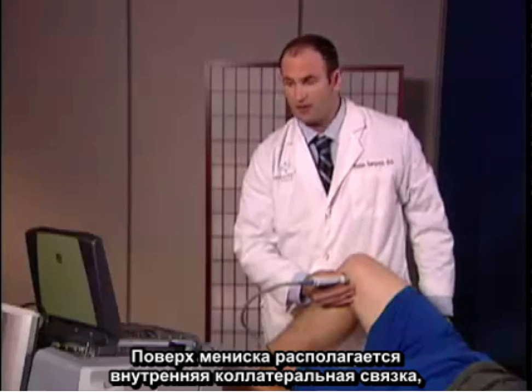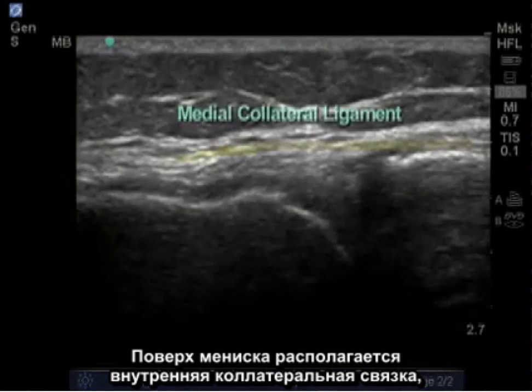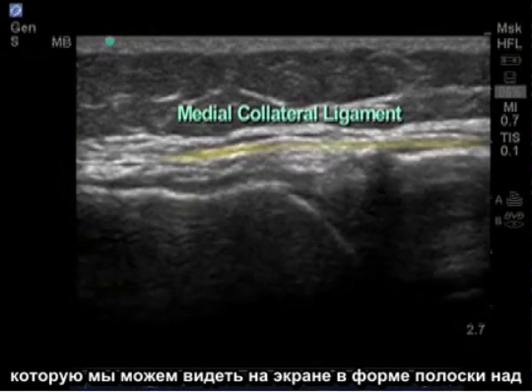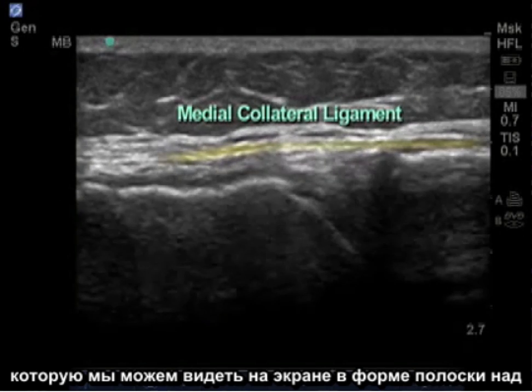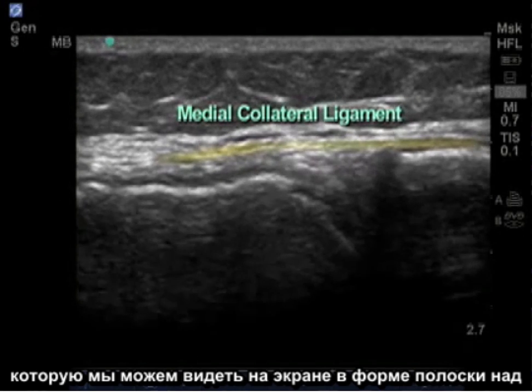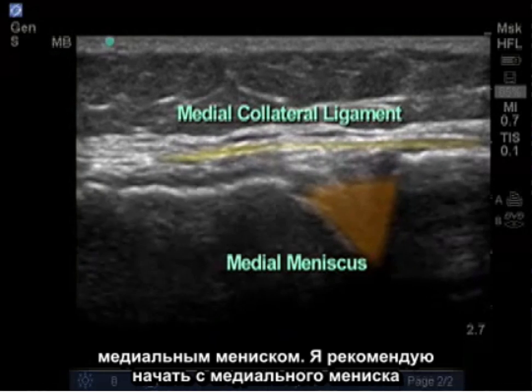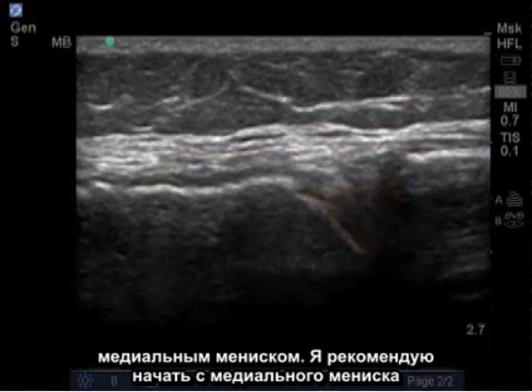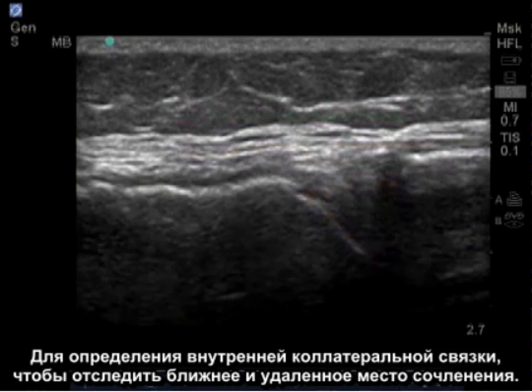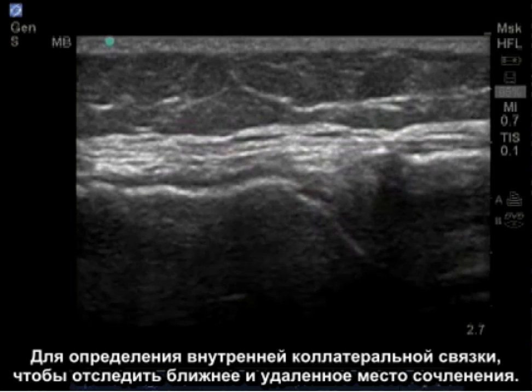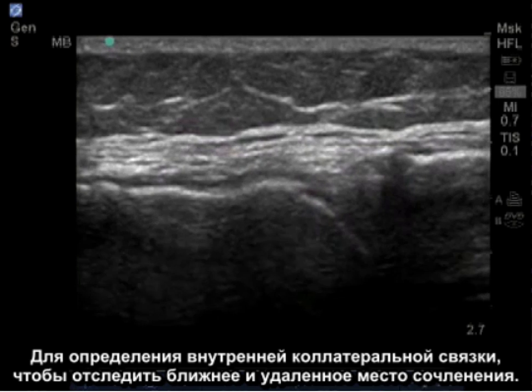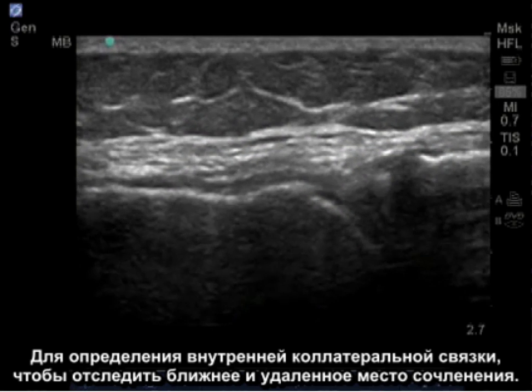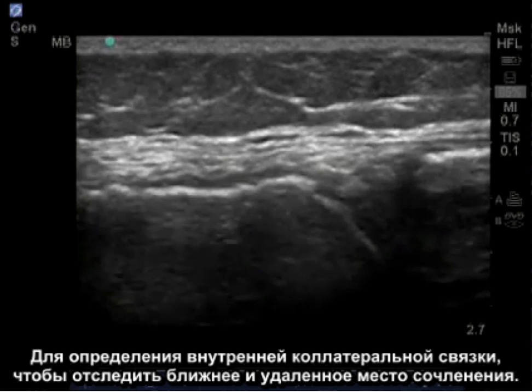Overlying the meniscus lies the medial collateral ligament, which is a band-like structure that we can see directly above the medial meniscus. I recommend starting at the medial meniscus to identify the medial collateral ligament and then tracing the ligament at its proximal and then distal insertion.